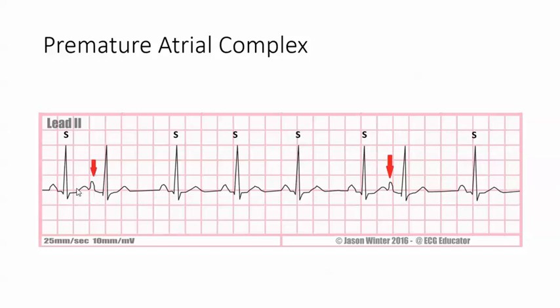Look at the P waves here and here. You notice that they are P waves, but they look different. That's a clue. When you have P waves that look different from the other P waves along with an irregular rhythm, that's a clue that it's a PAC. You can see that this beat should have happened here, and this one should have happened here — so you can see that it's premature.